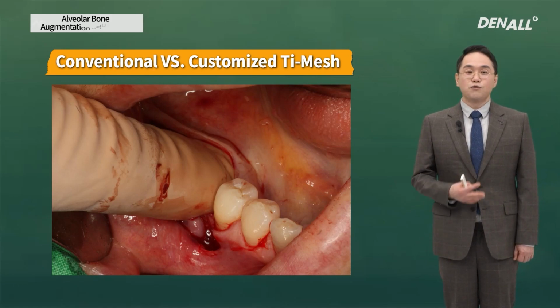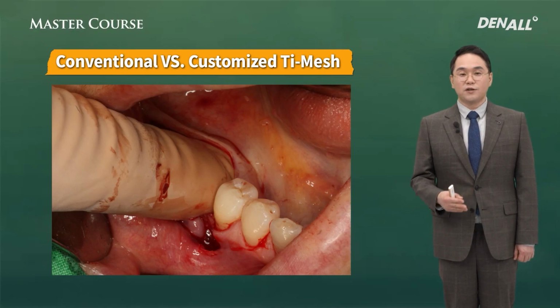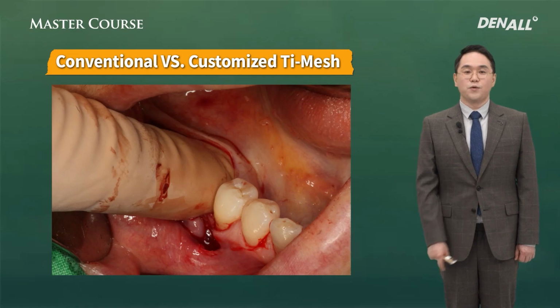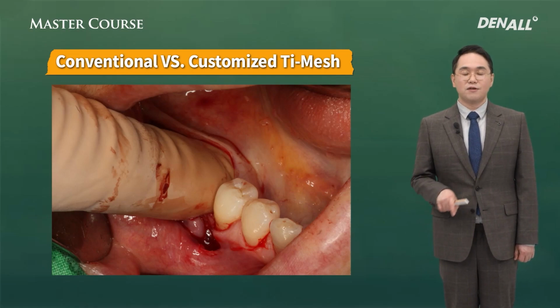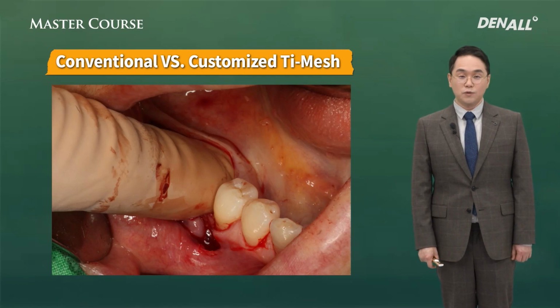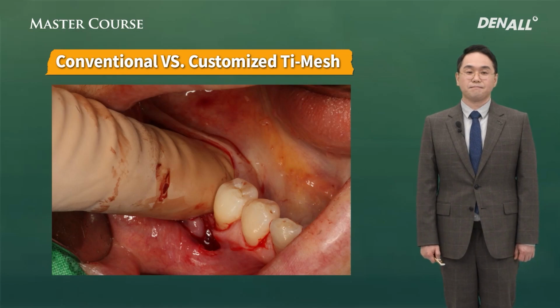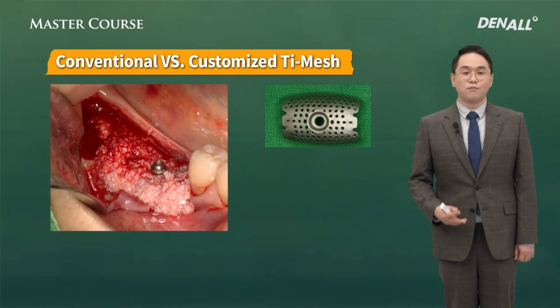That is the benefit. If you use an instrument, the sublingual artery or lingual nerve can be damaged. So if you use an index finger to do blunt dissection below the mylohyoid ridge, the lingual flap can be advanced.